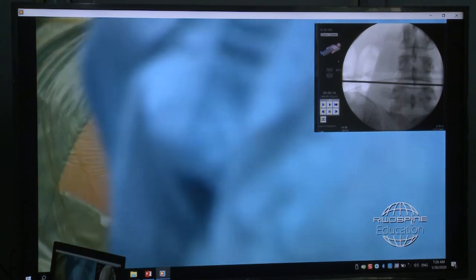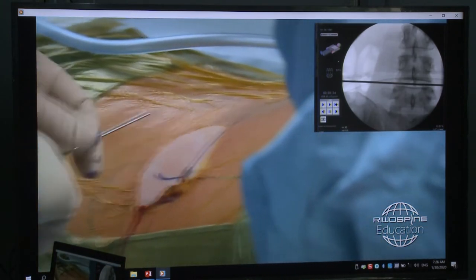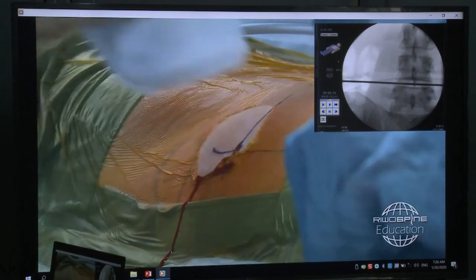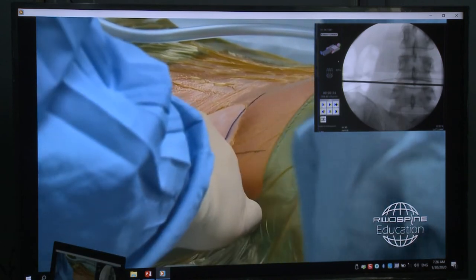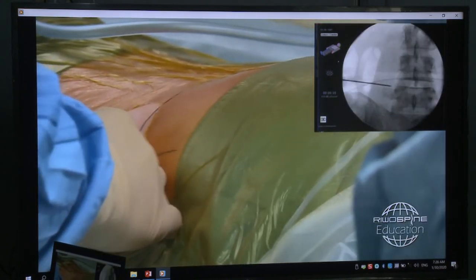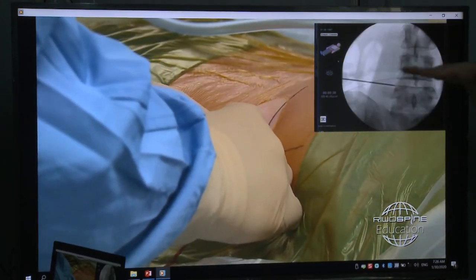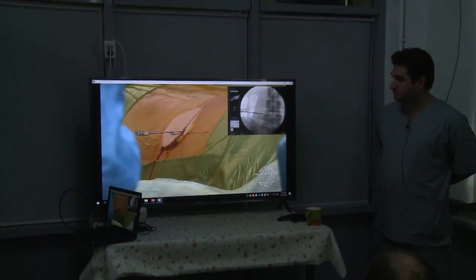Now we insert the needle. The assistant keeps his hands on the muscles of the patient to see if there's any reaction while we perform the approach. I'm going to compress it again. So we insert the needle, and I feel a resistance here. It's always good at the beginning to stay on the caudal side to avoid damaging the root. And we have to check where we are in the lateral C-arm position.